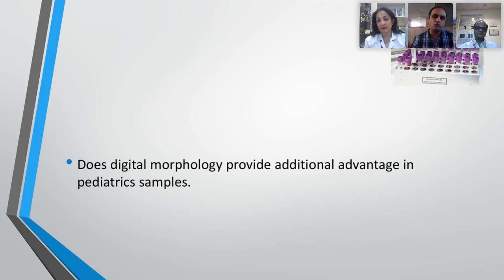So you have to go through all these cells, and then you can very well reclassify. So I won't say this is a limitation. This might take some more time, but this is not a limitation. Pediatric samples go very good. Just that we cannot rely on the pre-classification, as ma'am said, that the consistency and reproducibility is hardly 50%.